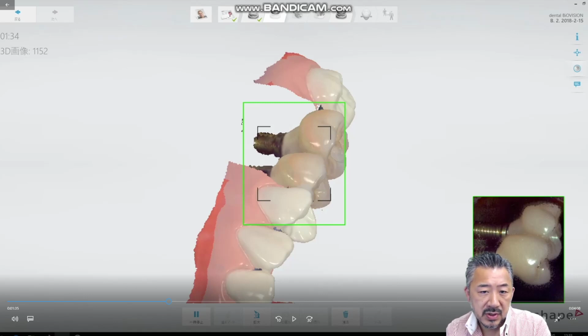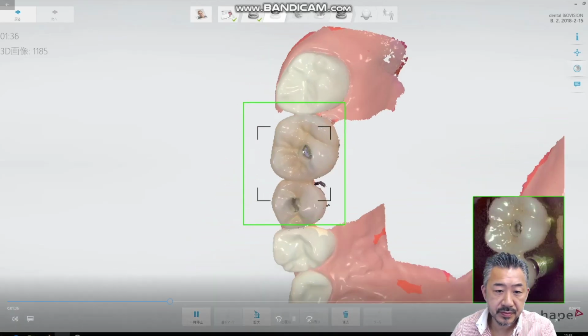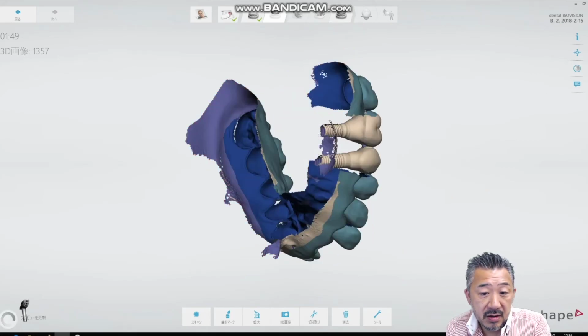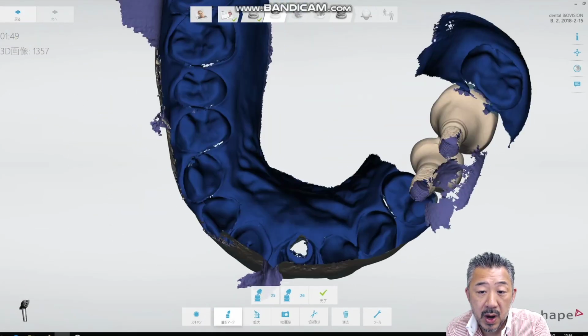One thing to keep in mind is to keep it exactly above the provisional sub-gingival and only trim below. If you look at it in color, you can see that surface-locked parts are coated whitish.